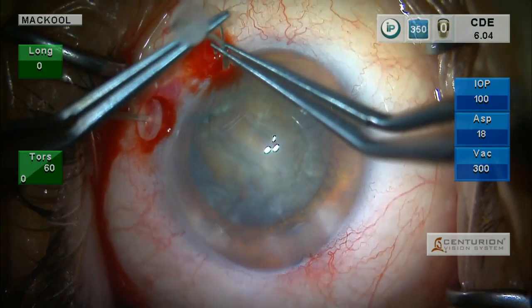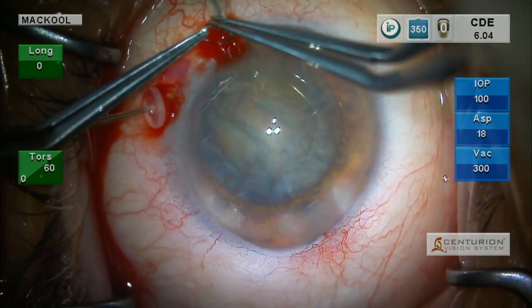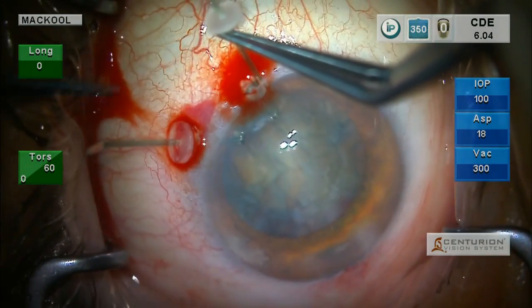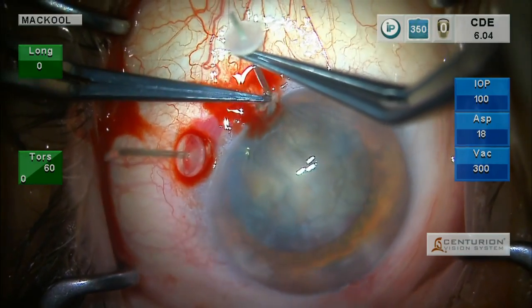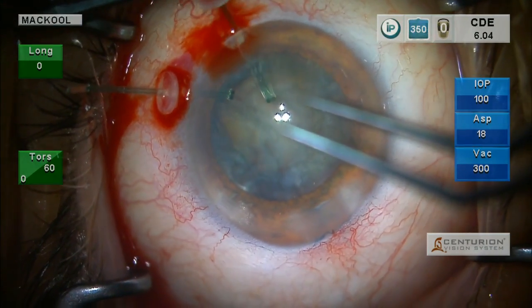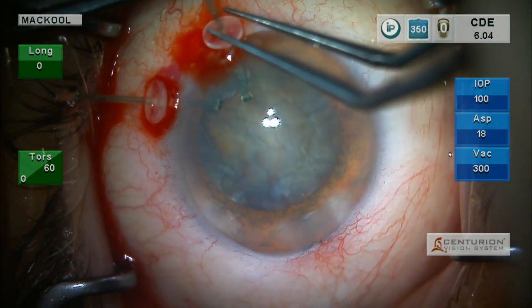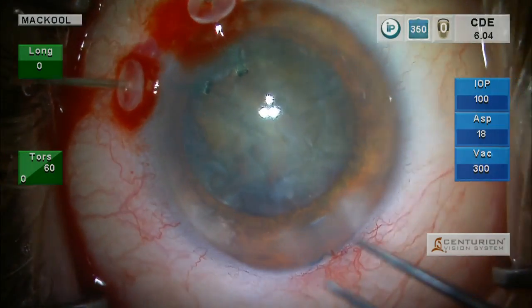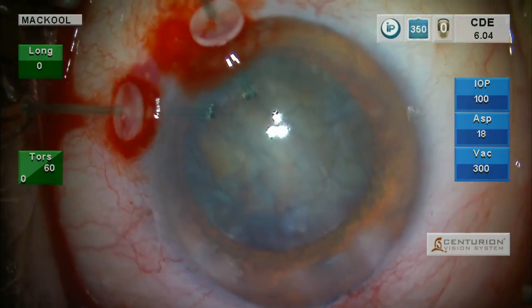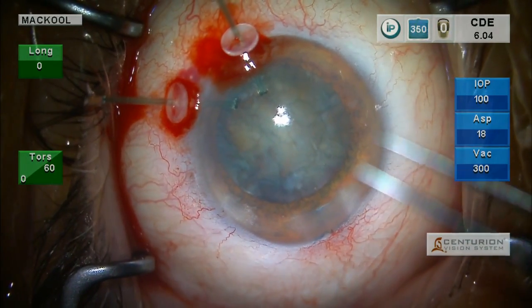Here's our second retractor — this is a little bit of a tighter fit, but I think it's going to go. I'm going to just massage it a little bit on the top to get it to pop in. It came in — I was going to use a hook and pull it in, but I don't need to. Here's our side port incision — I could put a third one right here, and I'm really going to. It may be more than I need, but better more than less.